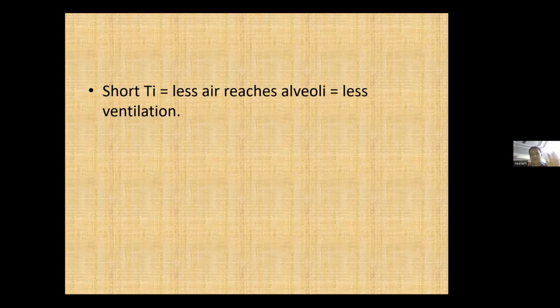But if you keep it very low, if you keep that TI at 0.2, what will happen is that you are not giving time for the air to go from the ventilator to the distal alveoli. So there will be less ventilation.